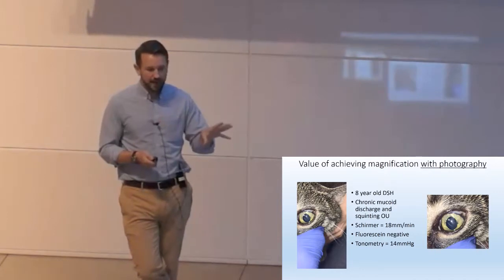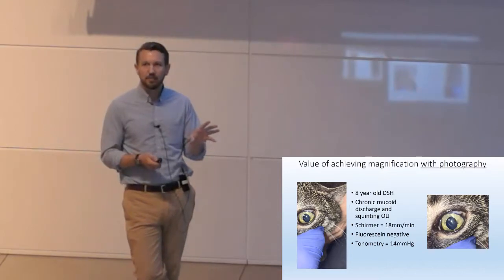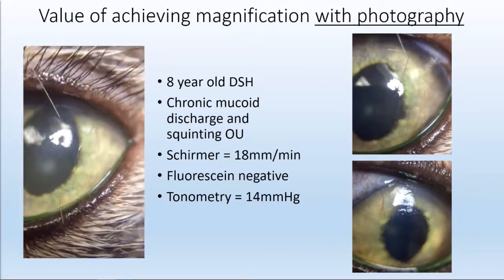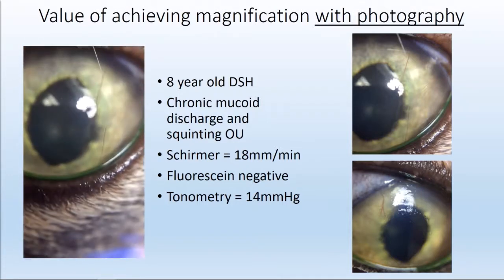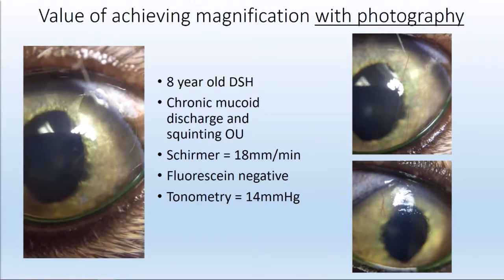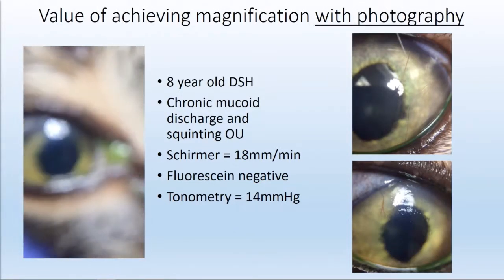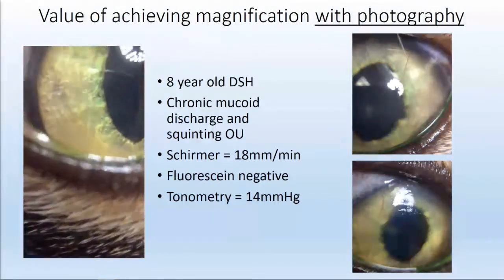With the magnification that we have right now, I don't have any other surface characteristics that tell me what disease this cat might have. But we'll talk about techniques, and with photography, I can get a video that is 4 times magnified, a video where I can get still shots, and you're seeing them on the right-hand side, and I can find superficial vessels traversing through the cornea. I don't see any intraocular disease, and I know that feline herpes virus is the most common cause of keratoconjunctivitis or ocular surface disease in the cat.